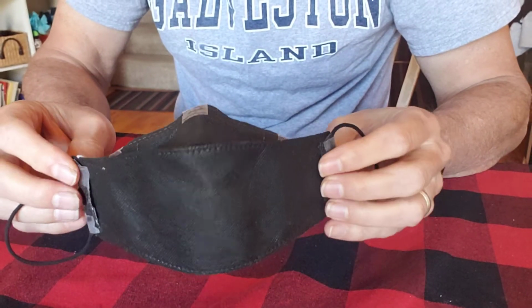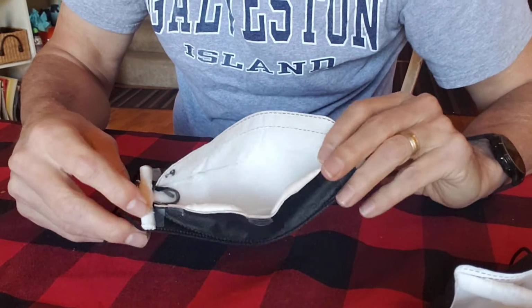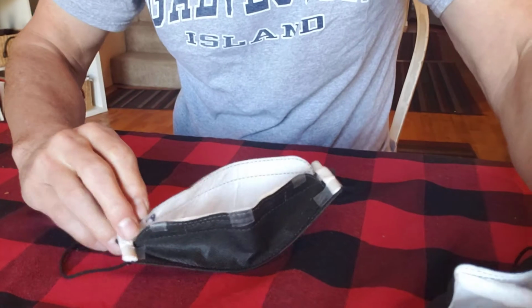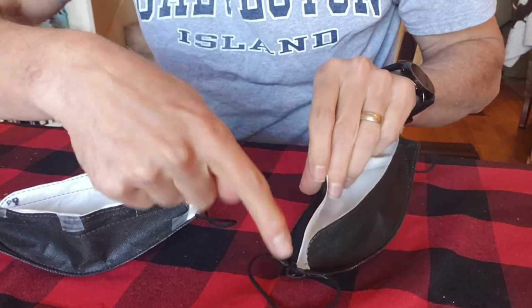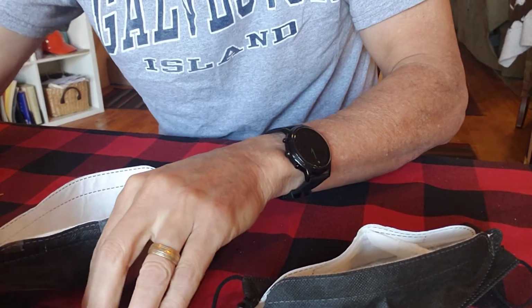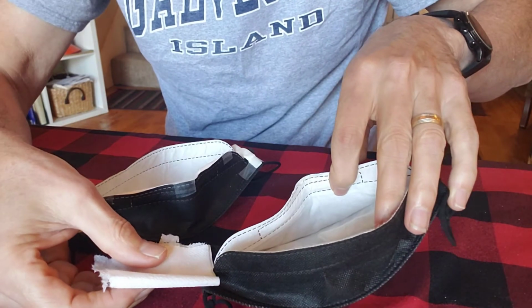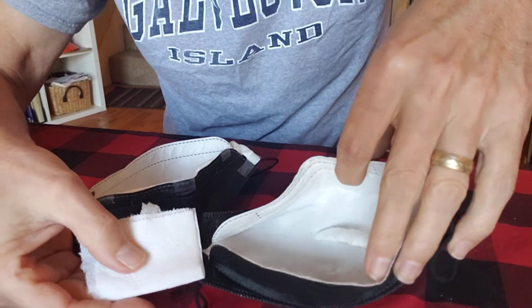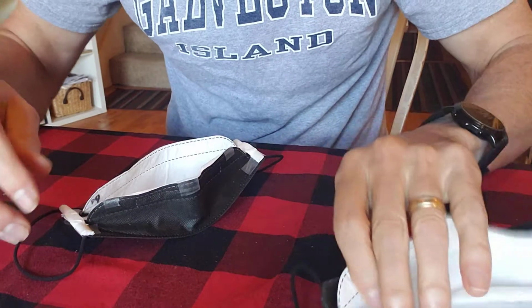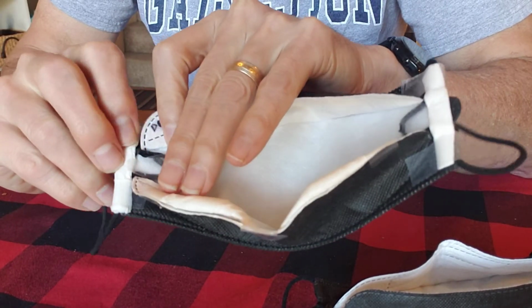So another thing that I've done with this that you may have noticed, when you compare it to a normal mask, is I also sealed up the sides of the mask with toilet paper. The normal Bluna has a little strip right along here, which is a perfect place to lay toilet paper that is half the width of a piece of toilet paper, so that it lines up right along this ledge here. And when I fold out the ledge, here you can see, it goes right onto the toilet paper, and it's a good seal.